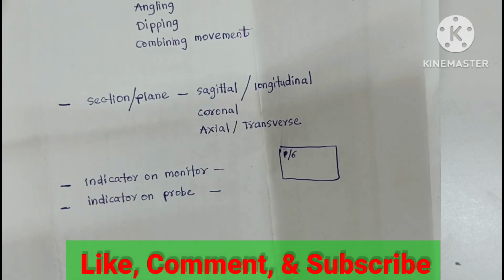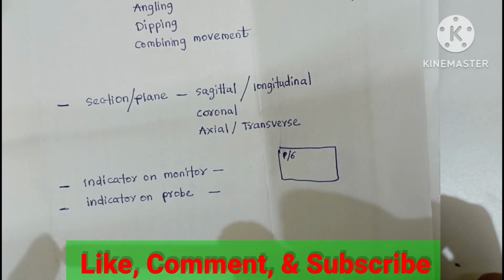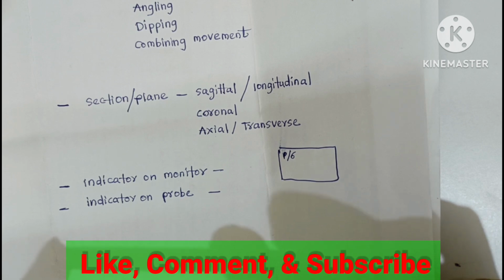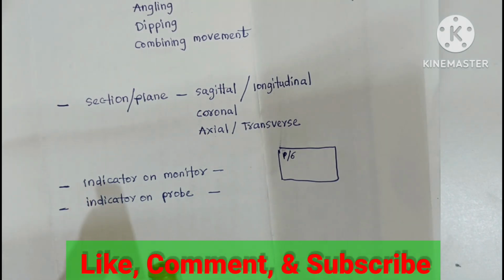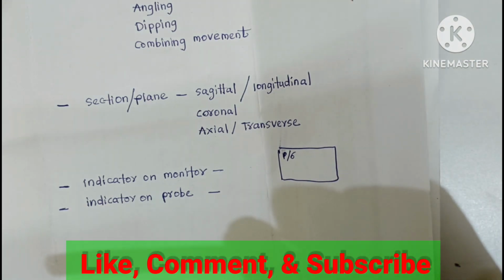In case of transverse section, that is when we are cutting the organ or body transversely, the probe marker should be present towards the right side of the body. But in case of longitudinal section, that is when we are taking a longitudinal view of an organ, the probe marker should be present towards the patient's head. Remember, you should not forget this while taking longitudinal and transverse views of your organ in ultrasound examination.